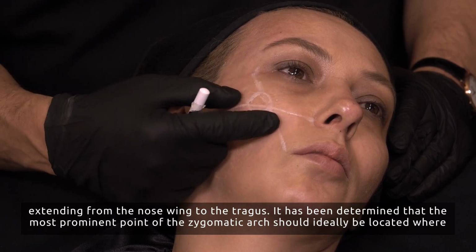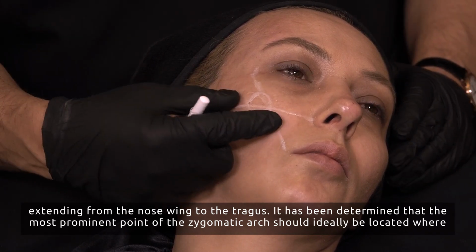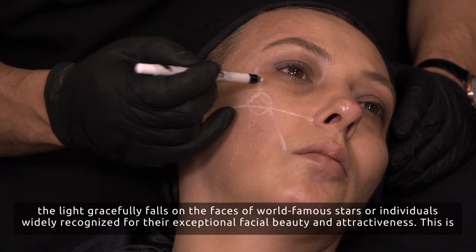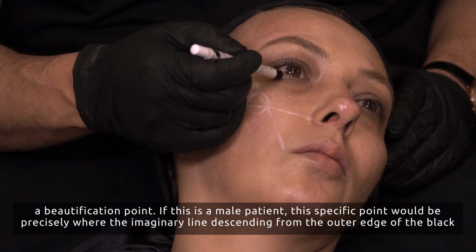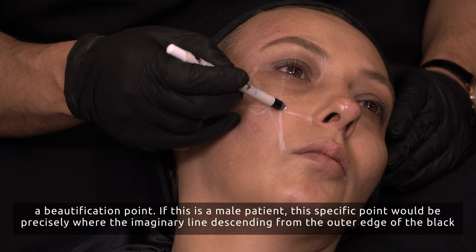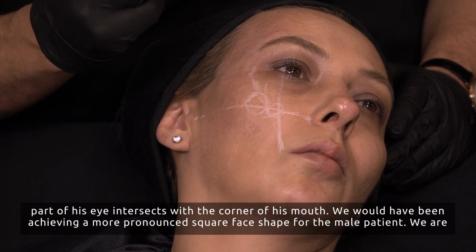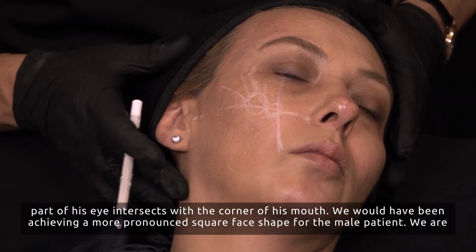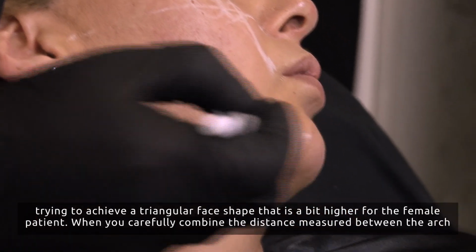It has been determined that the most prominent point of the zygomatic arch should ideally be located where the light gracefully falls on the faces of world-famous stars or individuals widely recognized for their exceptional facial beauty and attractiveness. This is a beautification point. If this is a male patient, this specific point would be precisely where the imaginary line descending from the outer edge of the black part of his eye intersects with the corner of his mouth. We would be achieving a more pronounced square face shape for the male patient. We are trying to achieve a triangular face shape that is a bit higher for the female patient.